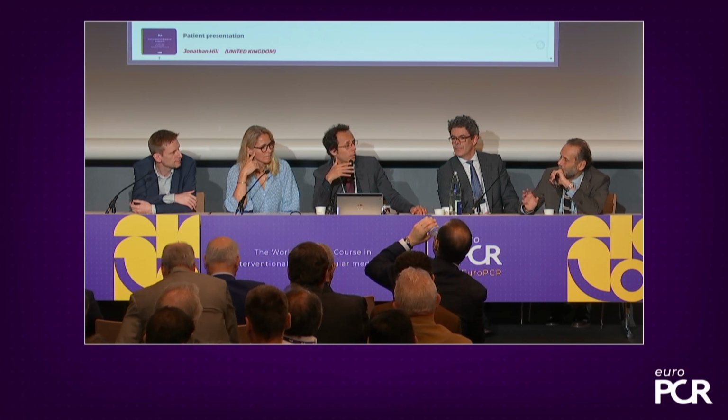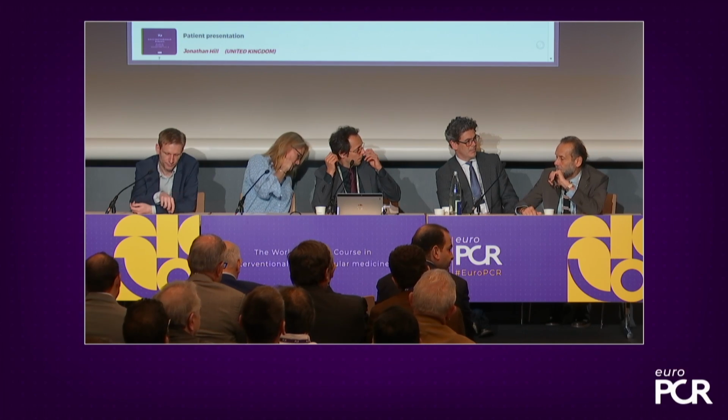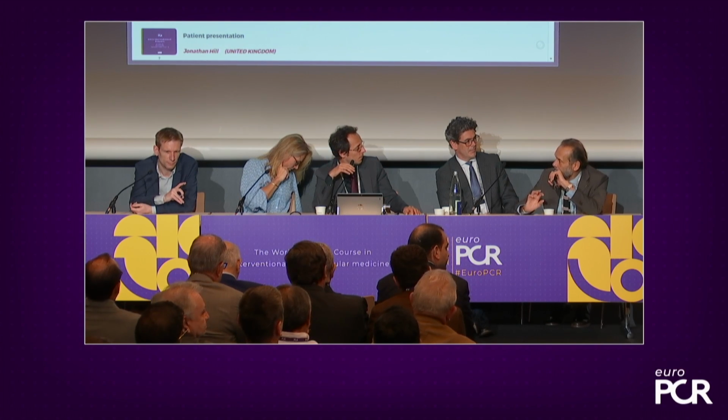I mean, the question, you know why I'm asking this question is because there are... Sorry, it looked like a very short calcium nodule, but it's very important in this case to assess it with imaging, I think, because we don't know really if there is a length of calcium more than 2 or 3 or 4 millimeter, because it's not so evident at angiography. I think that I would choose the right tool after the imaging. I think that this is a crucial point.